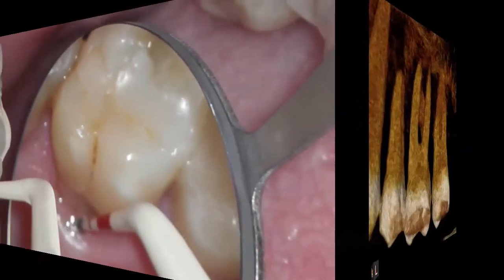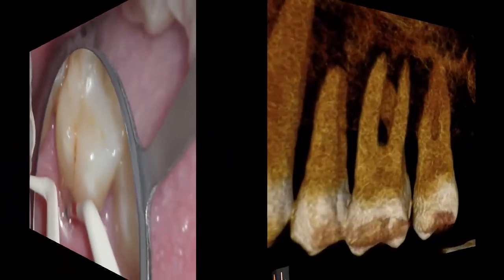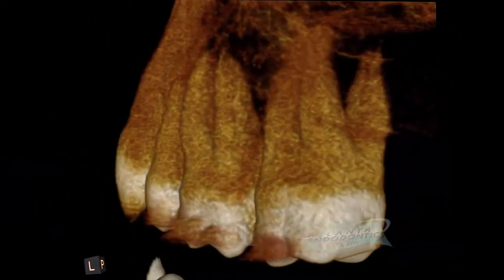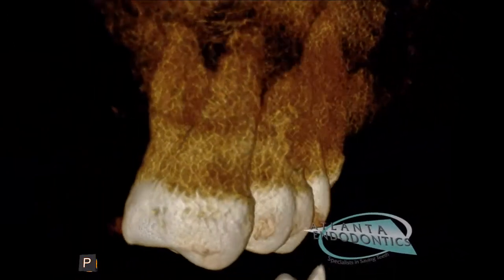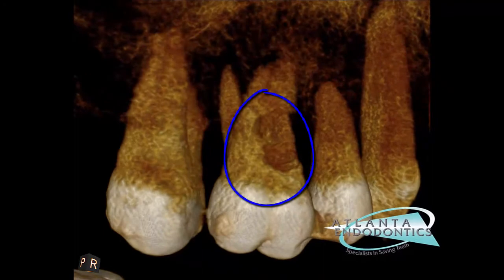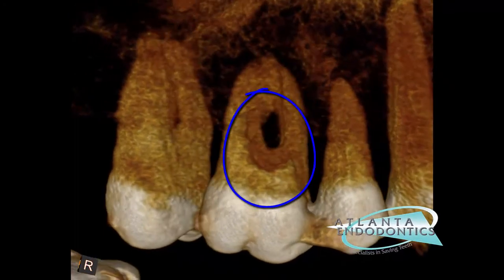The 3D rendering on a cone beam scan confirms the resorption defect on the palatal root of the upper first molar.